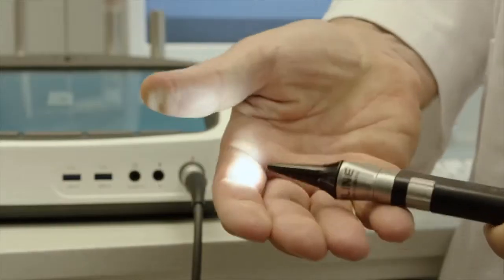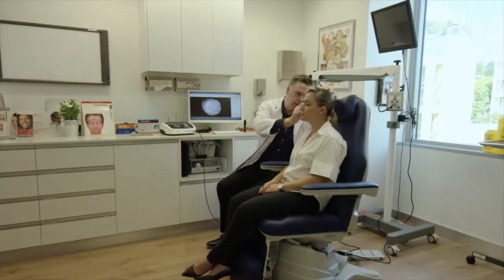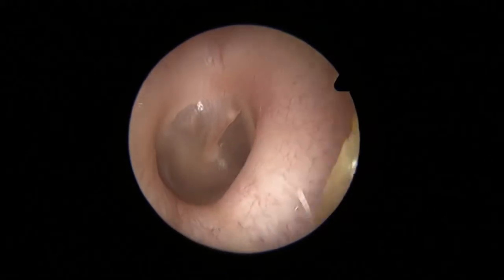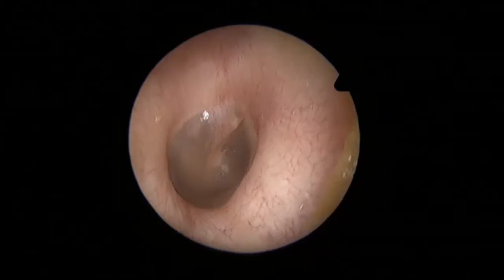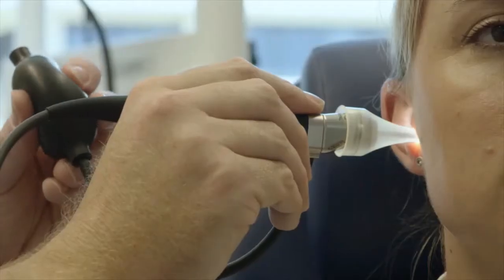Utilising the high intensity LED illumination in the handpiece, the otoscope probe provides brilliant video of the inner ear. The otoscope probe has been ergonomically designed for simple operation and maximum patient comfort. A pneumatic adapter is also available for the otoscope probe to facilitate movement of the tympanic membrane during the examination.